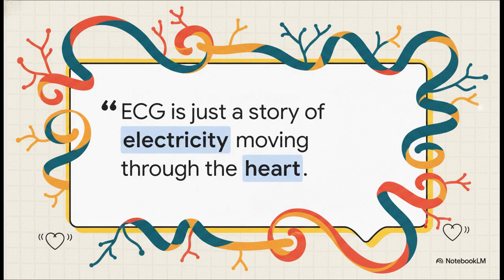That is the core idea we're going to unpack today. Forget about deciphering a secret language. We are simply learning to read the narrative of every single heartbeat. And trust me, it's a powerful story, and you're about to become fluent.